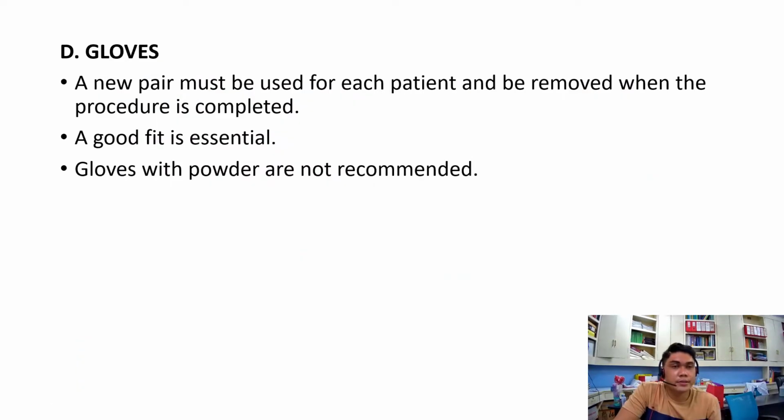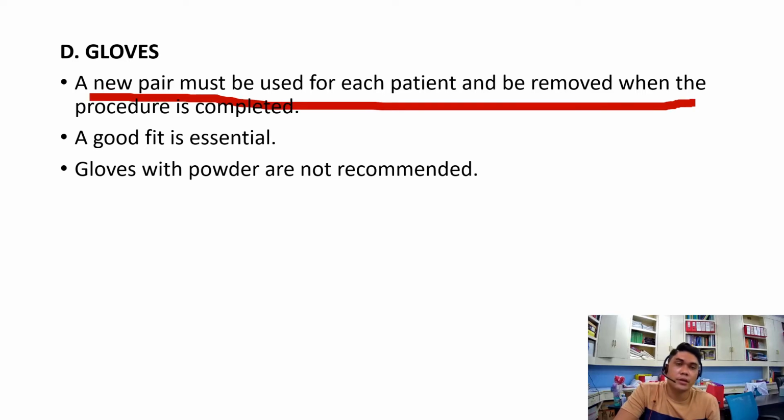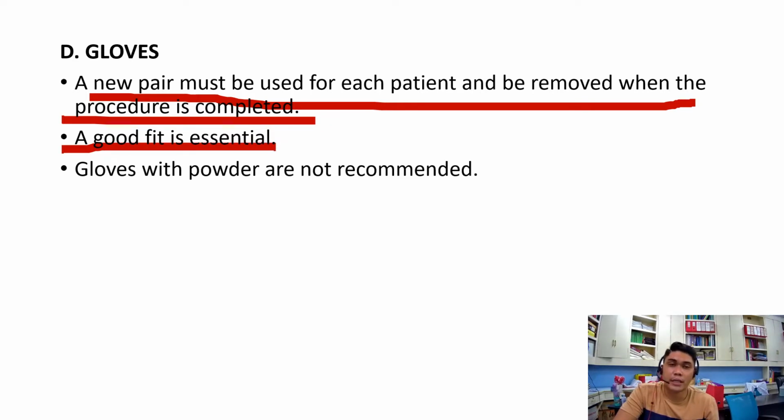Okay, so next supply, it's gloves. A new pair must be used for each patient, and be removed when the procedure is complete. The protocol is to use one pair of gloves per patient. A good fit is essential, so choose the size that fits your hand properly.